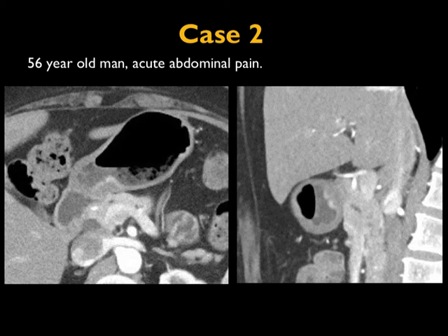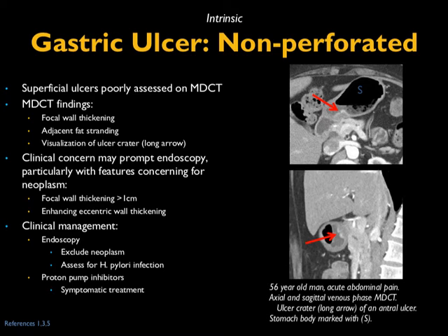Another case: there's some food in the stomach, but you see wall thickening particularly in the region of the greater curvature with enhancement at that point. This is actually a gastric ulcer that did not perforate. You can particularly see the area of focal thickening and ulcer on the sagittal view. Distinguishing a benign ulcer from a neoplastic process can be a challenge — when it's more bulky or there are nodes, I'm thinking neoplasm.